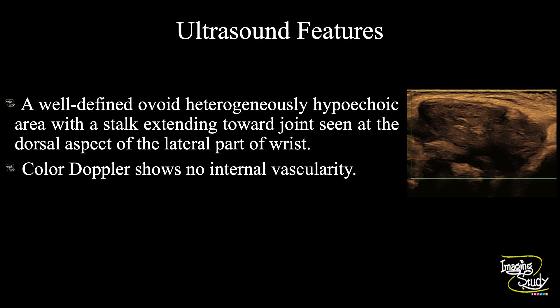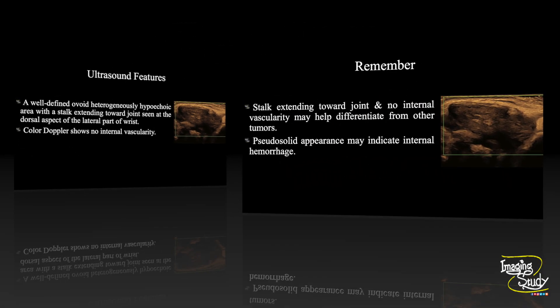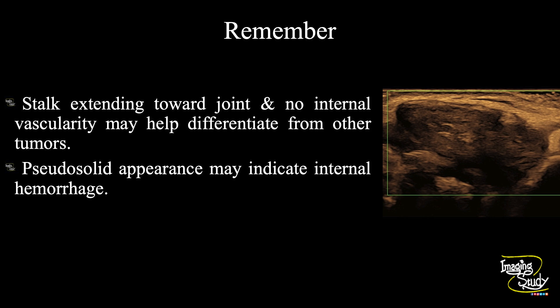In summary, a well-defined ovoid hypoechoic area with a stalk extending toward the joint is seen at the dorsal aspect of the lateral part of the wrist. The color Doppler shows no internal vascularity. These features conclude it as a case of ganglion cyst. The take-home message: a stalk extending toward the joint and no internal vascularity may help differentiate from other tumors. The pseudosolid appearance of the ganglion cyst may indicate internal hemorrhage.